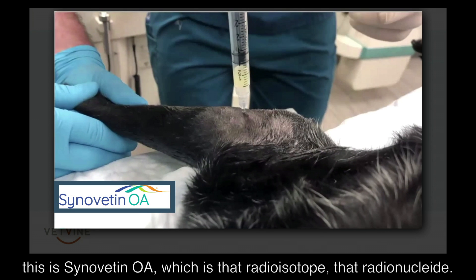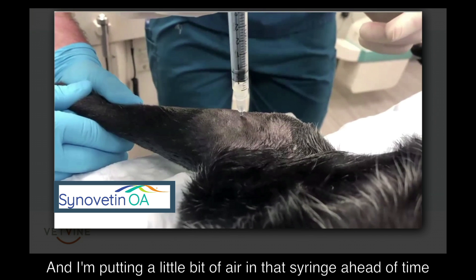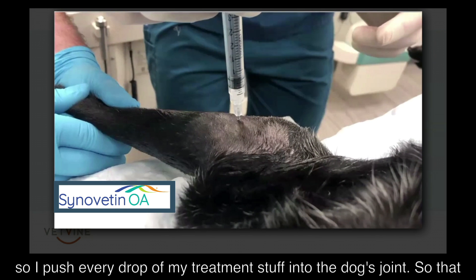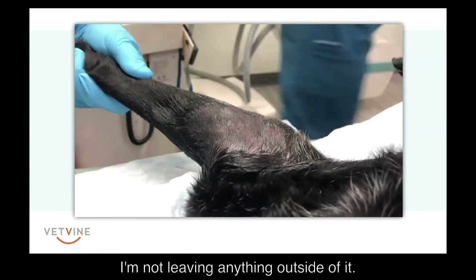Then I'll attach whatever product I'm injecting — in this case, this is Synovatin OA, which is that radionuclide. I put a little bit of air in that syringe ahead of time so I push every drop of my treatment into the dog's joint, making sure I'm not leaving anything outside of it.